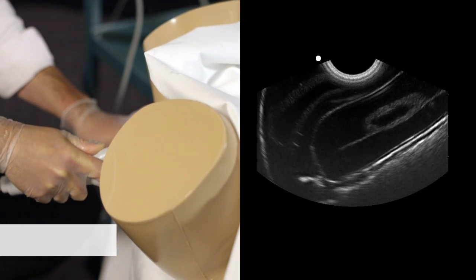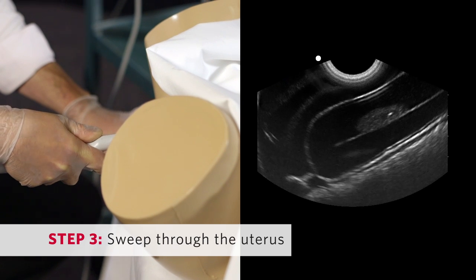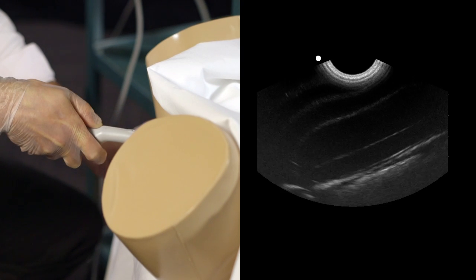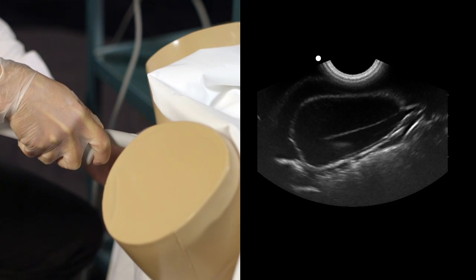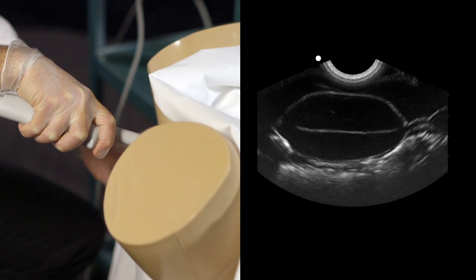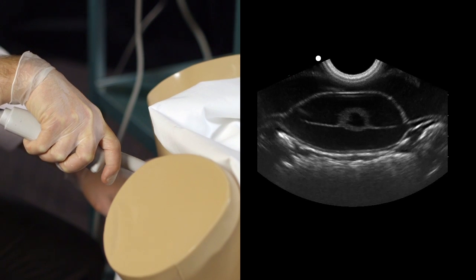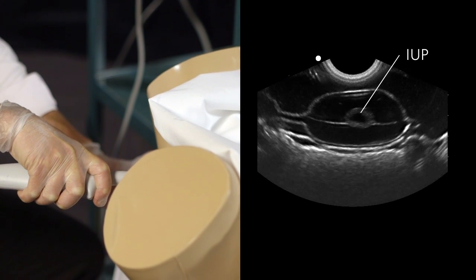Now that you have identified the uterus, sweep through it in the sagittal orientation. The simplest way to do this is by flexing and then extending your wrist. Rotate the probe so that the marker faces toward the patient's right. Once again, simply flexing and extending your wrist will allow for a full sweep. Sweep through the entire uterus to identify a definitive pregnancy, focusing on the area of the endometrial stripe.